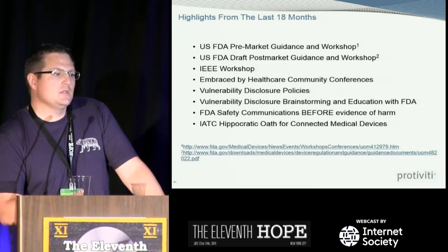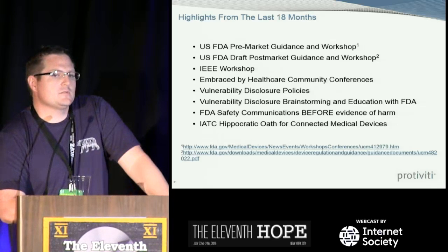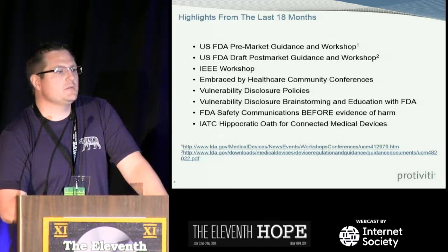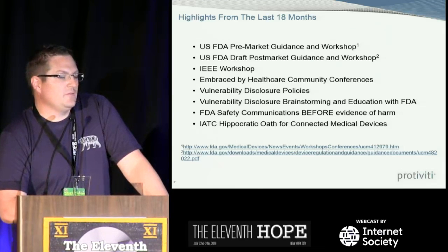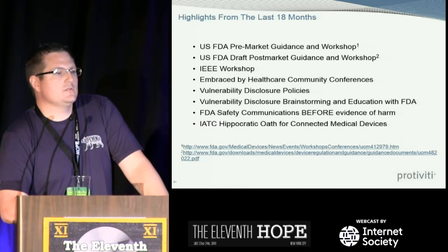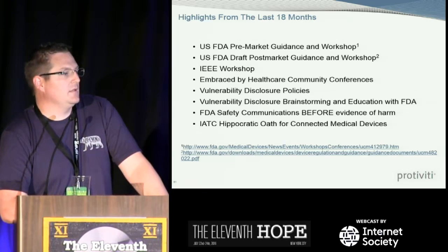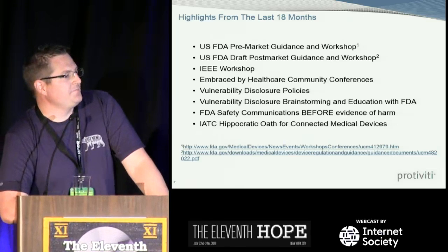Vulnerability disclosure policies: 2 years ago, we didn't have a single device manufacturer that had a coordinated vulnerability disclosure program. And now, 2 years ago at DEF CON, Philips Healthcare was the first one to announce that they were going to do it, and they finished it at the end of that year. So they were the first healthcare organization to implement coordinated vulnerability disclosure, and now there's more. Draeger has done it and announced it at B-Sides last year. Philips and Medtronic have a dedicated website. GE has a dedicated reporting method. So it's getting better, and now it's in the FDA guidance.